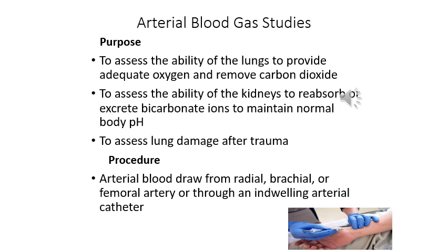Arterial blood draws are from the radial, brachial, or femoral artery, and they can be through an indwelling arterial catheter. An ABG test can be painful. It's definitely uncomfortable. Typically, they're going to do it from both sides of the wrist. That's where I most commonly see that being done in the hospital. And typically, when a provider orders an ABG, they don't just order it on a whim. There's something that possibly leads up to it, or they're trying to rule something out, by looking at that patient and the symptoms that are going on.